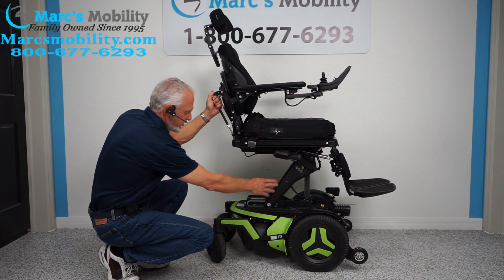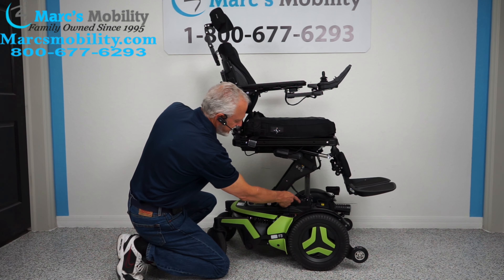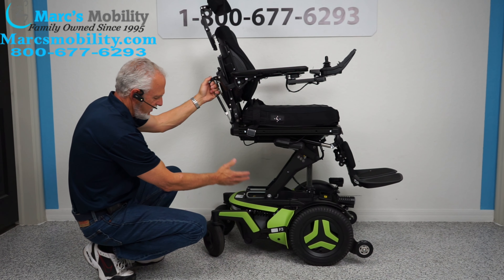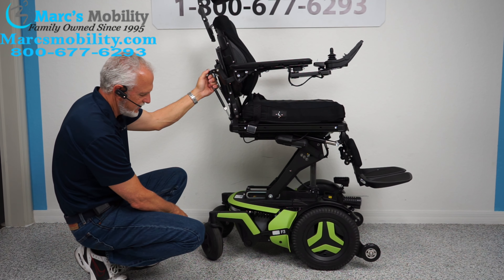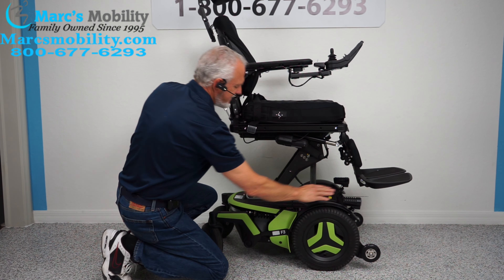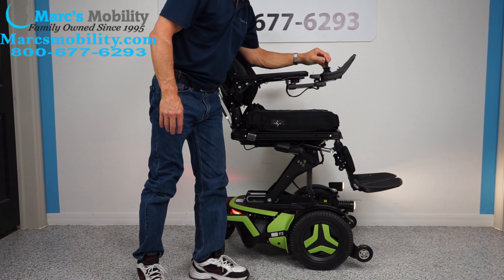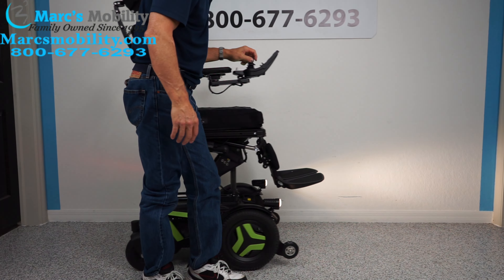You can actually see the armature here for the seat lift. The actuator is right here to make the seat go up. You can see how nice this chair is. You also have lights — let's talk about these lights right now since we're at it.